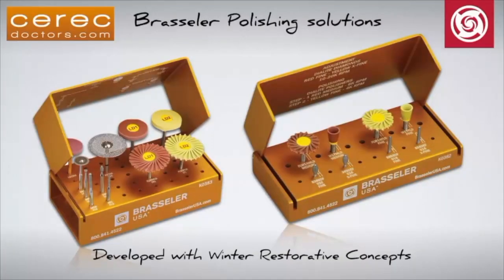Hello, and welcome to this video of the new CERECDoctors.com Polishing Solution Kits by Brassler USA. In this follow-up to the introductory video released last year, we will go into more detail regarding both the intraoral and extraoral polishing kits.